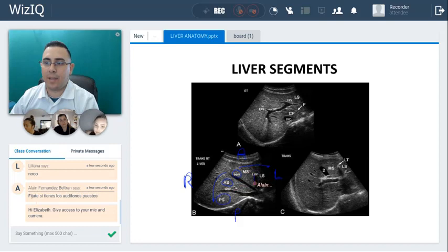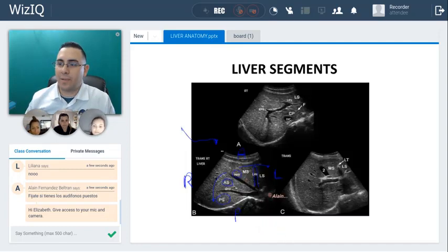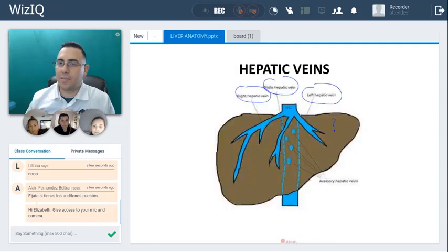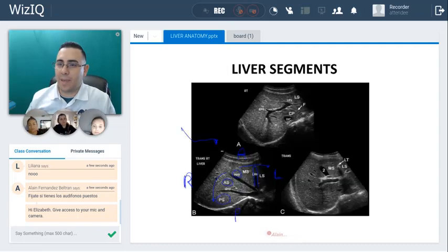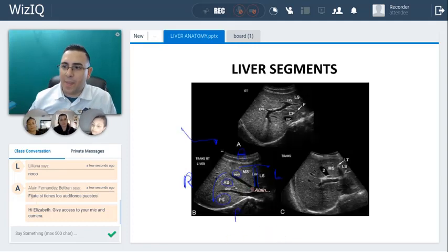Now the left hepatic vein, this one right here, divides the left lobe of the liver into the medial segment and the lateral segment. Take a look at this picture here and apply the same thing — it's lateral. So take note: the middle hepatic vein is in between the medial segment and the anterior segment. That's good to know.